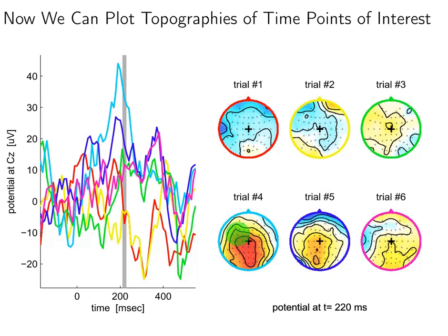Trial 4 represents some interesting localization, or observation of higher amplitude ERPs around CZ. This kind of visualization also gives us information about spatial features, for example, which channel contains more discriminable, stronger ERPs at some fixed time point. We can also take the average between 200 and 220 and visualize it as follows.